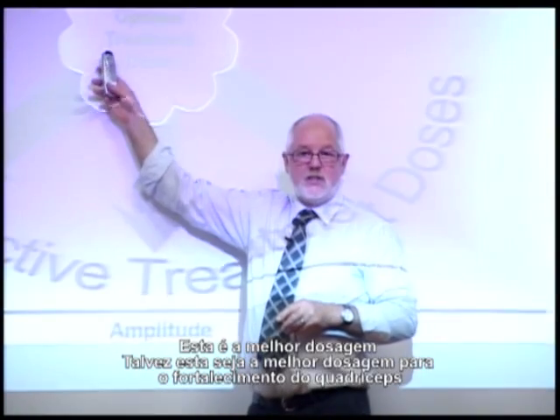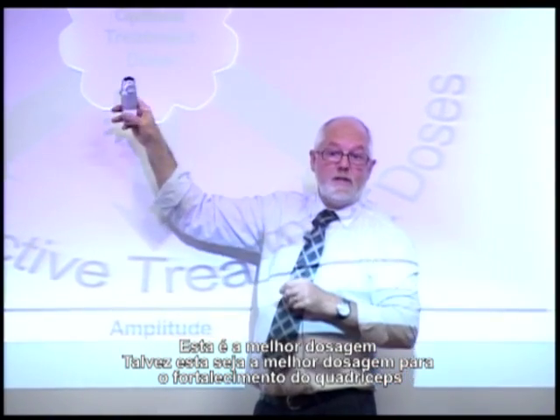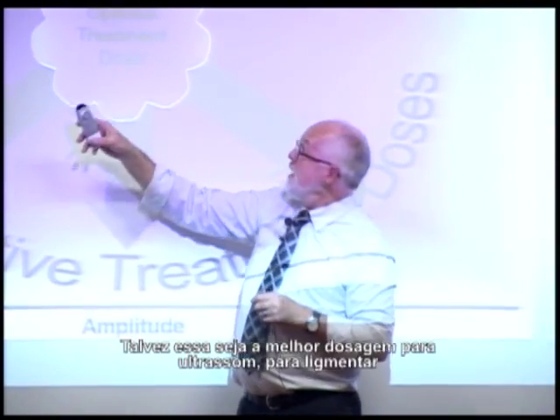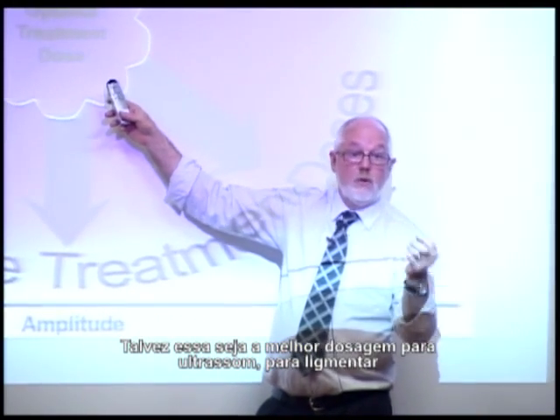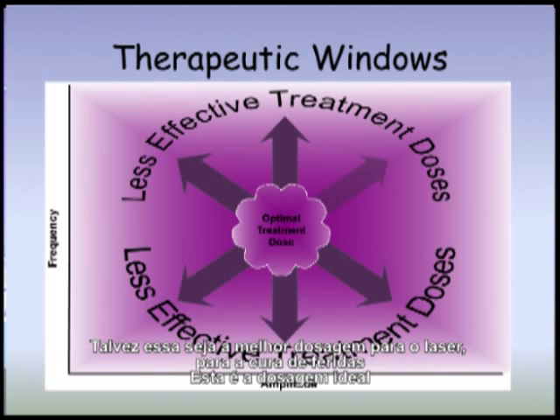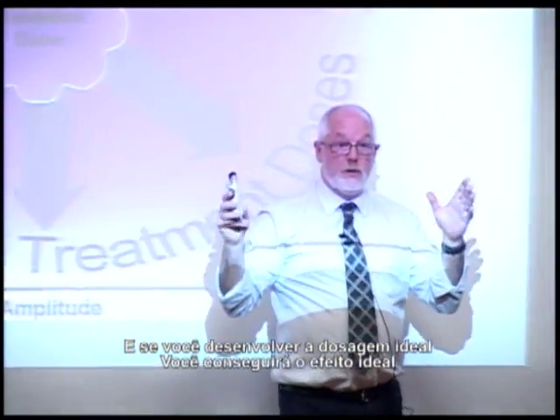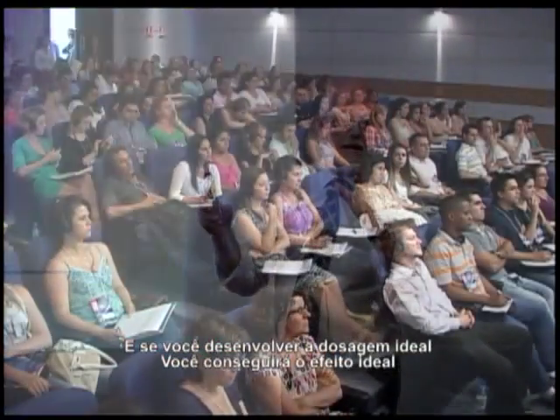This is the best dose. Maybe this is the best dose for strengthening the quadriceps. Maybe this is the best dose for ultrasound to a ligament tear. Maybe this is the best dose for laser for wound healing. It's the optimum dose.